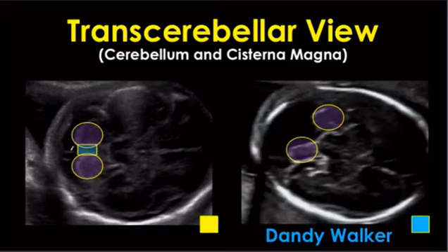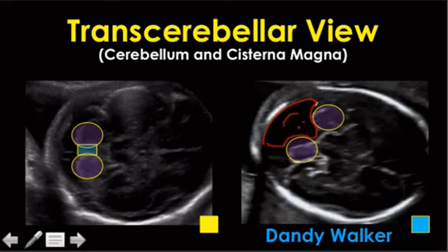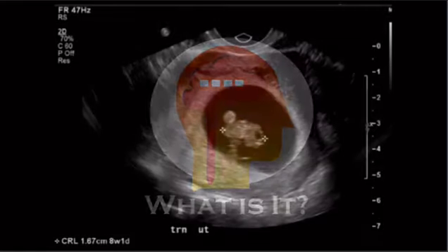It was little back here, but over here it's bigger, and it's got a dip in it, so it's got this kind of shape, sort of like a mountain, maybe, or a ghost, or one of those star cookies from Arby's. This one didn't get formed right, just like a Dandy Walker didn't get formed right. All right, so moving on.